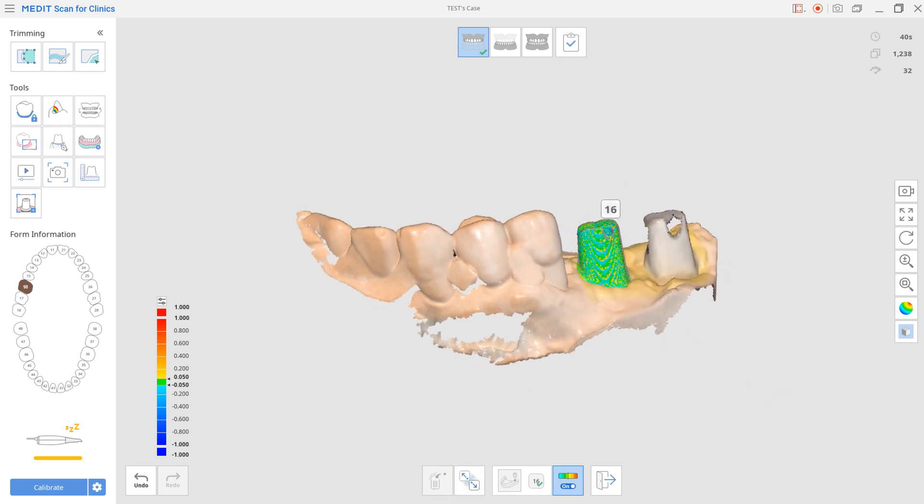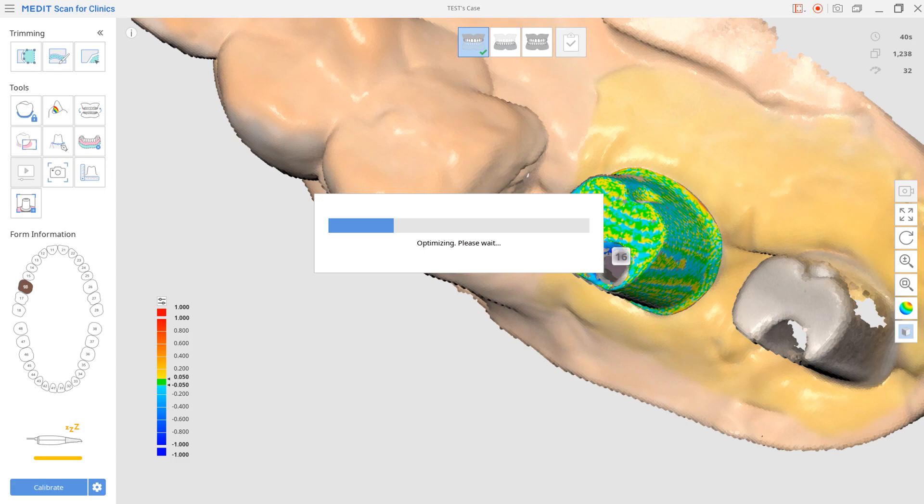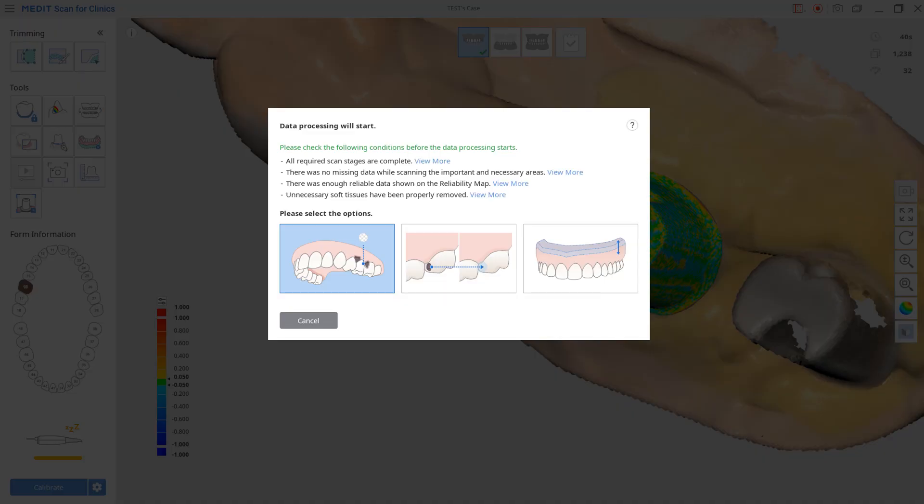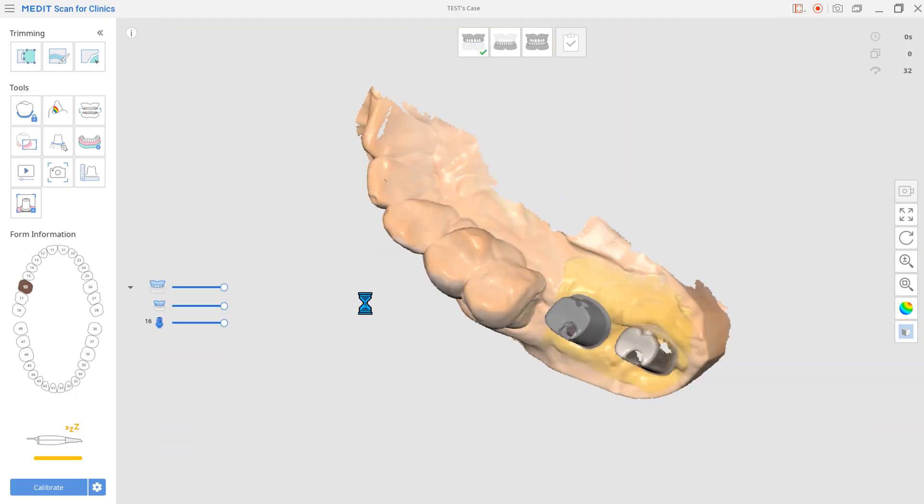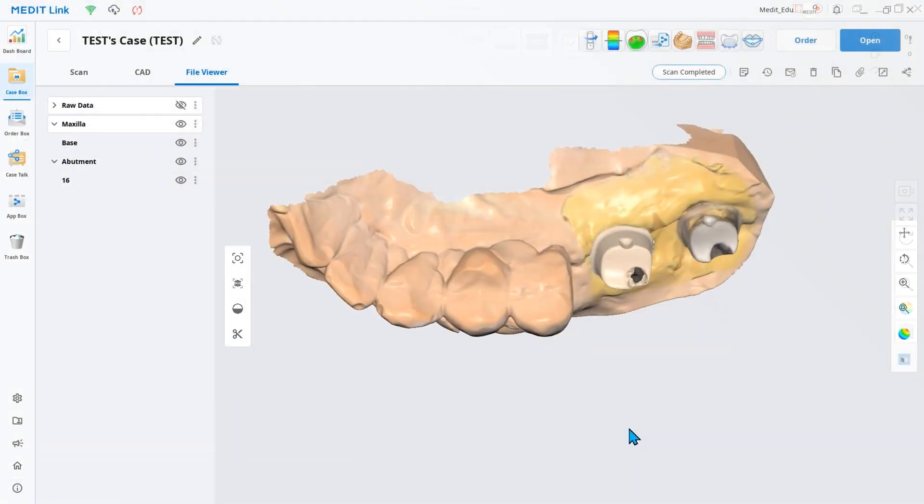When the scan is completed and saved, it is created as a separate file in MeditLink's file viewer.